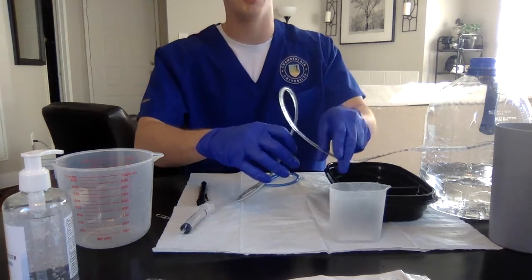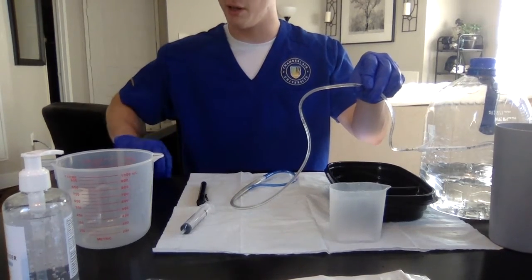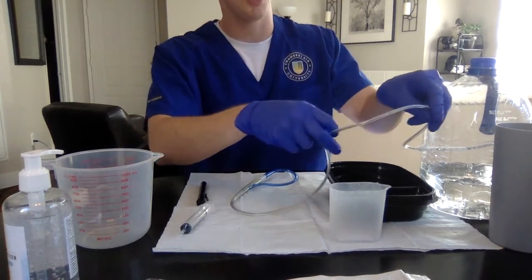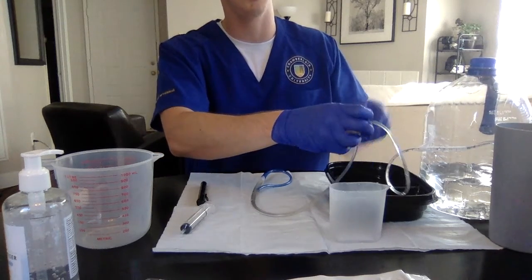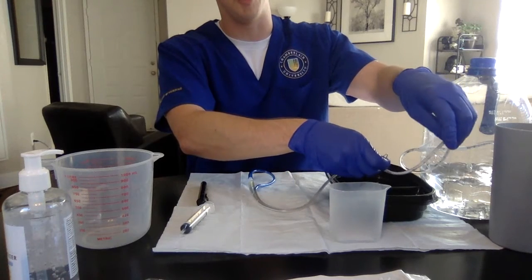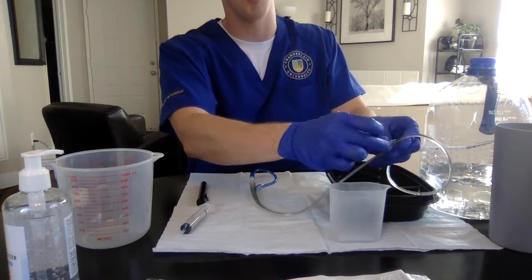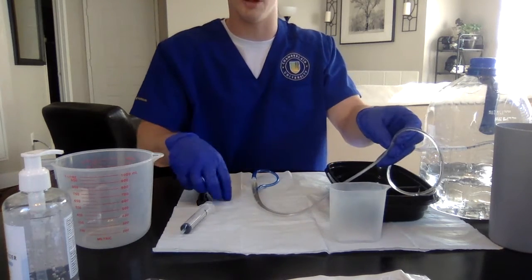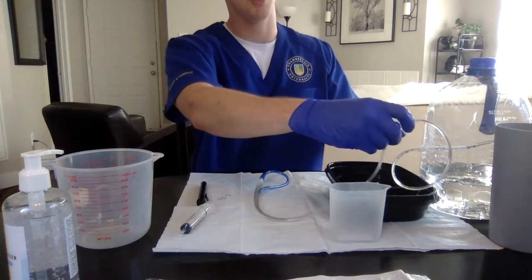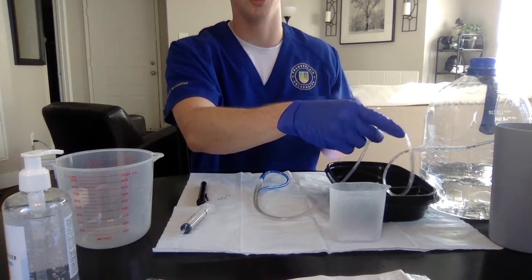We want to attach this to our client's gown. So we're going to use our paper clip and rubber band here. So just like the Foley catheter, we want to attach it to their gown somewhere that they're able to turn their head left and right and not have it be pulling on them. So I'm not able to connect it to anything. So I'm going to verbalize that we would connect this paper clip onto here and get it attached to their gown. And so once that's attached and they have their range of motion, our patient is going to be able to go down to X-ray now.